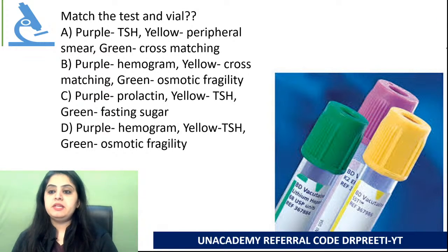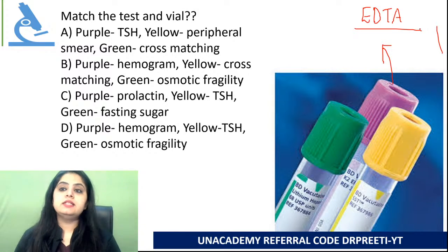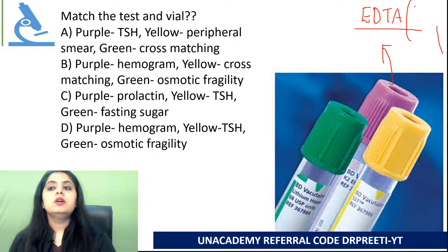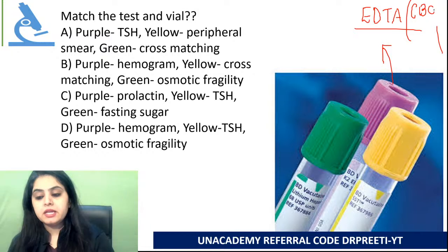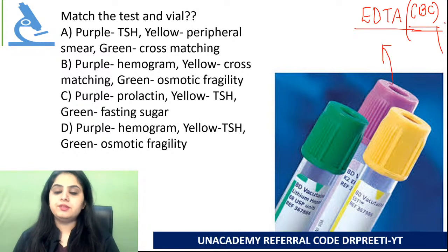Right, so first let me ask you the basic. What is a purple color vial? The lavender blue or the purple color vial, everyone knows it's the EDTA vial. So whenever I want to do a hemogram, a complete blood count, this is what we use, right?